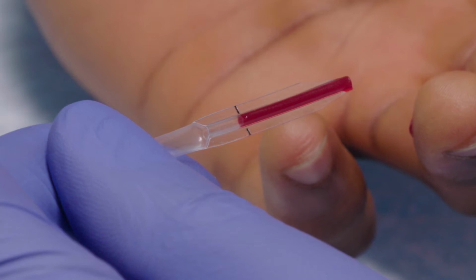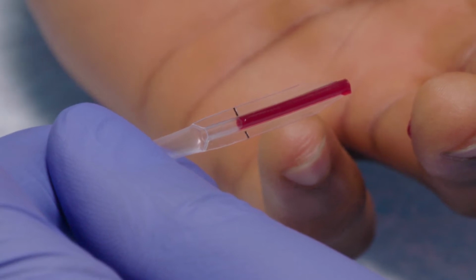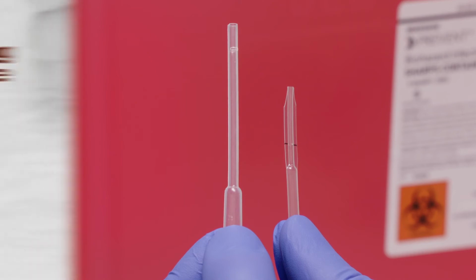If you overfill the disposable capillary tube, discard the tube in the biohazard bag and start again with a new tube. Note, some rapid HIV testers mistake the capillary tube for a pipette, but there's a difference between these two. The disposable capillary tube is used for a finger stick sample. The pipette is a similar tool, however it is larger and is used to take blood out of a vial or test tube from a venous blood sample.